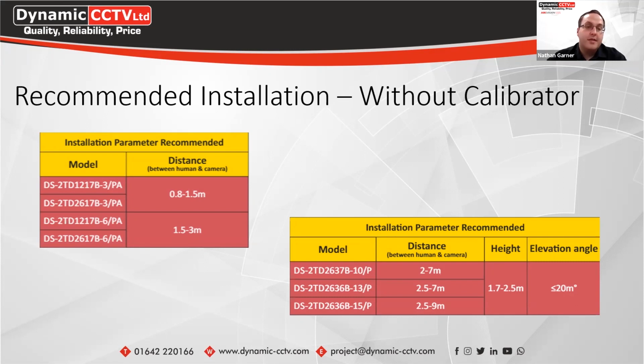So those are the different detection distances for each of the different models that we sell, as well as the mounting heights and also the elevation angles for them. I will be sending the slides out after this webinar, so you will have a copy of all this as well, which will make it easier on your installs.